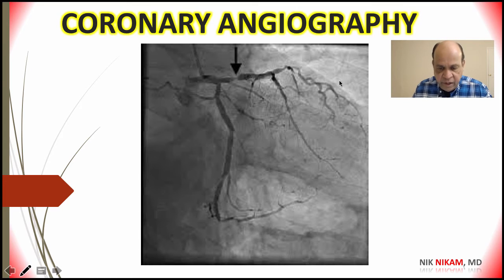So generally an acute STEMI can result in the anteroseptal region if we have an occlusion of the left anterior descending branch. As you can see, there is a critical stenosis here in the left anterior descending branch, and these patients may present with a non-STEMI clinical presentation because there is still some degree of perfusion visible in the left anterior distribution region. Similarly, there is a mild narrowing in the circumflex trunk in this artery.